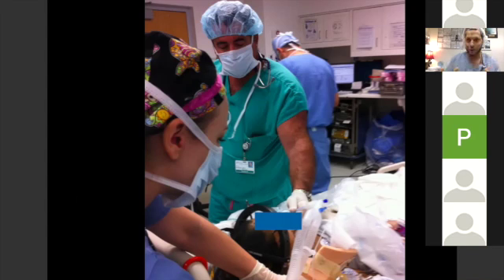And I'm like, I just spent all this time to minimize any kind of movement, and now we're hyperextended here. And so in those situations, sometimes it's good to get post-intubation motor evoked potentials prior to positioning to show that there was no problem from intubation. And sometimes you even do pre-intubation motors.